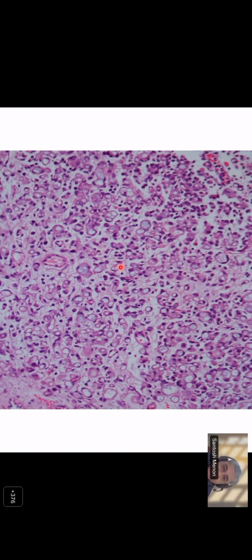So you see there is edema, and then these are completely... But I don't know whether you noted that they have got very thick, hyaline kind of thickening of the walls. In general, a signet would not have this thickening of this material. You can see this hyaline material here, and they have got this clustering and a little thickened appearance. That can occur in endothelium, definitely. Endothelial cells can have this thickened material in their wall, and they can look like this.